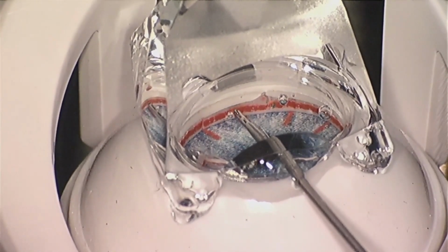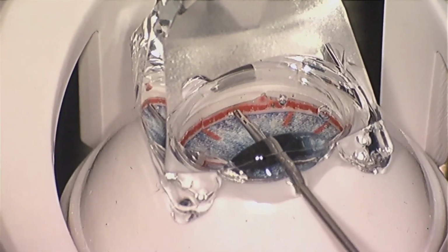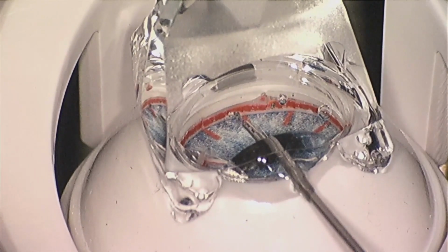With each of these devices, you get 4 fires, and so I've used 2 on the first stent, and now I did a third one which misfired, and then I do the 4th one there, and you can see that that remains in good position after I'm all done. Whenever it's not in good position, if you have it not implanted properly, if it's facing you how you want it to be, that's the easiest way to rethread the needle, so to speak, or rethread the trocar and get that stent into good position.